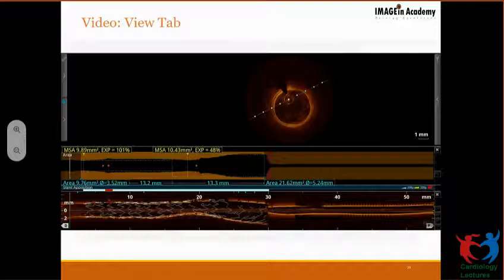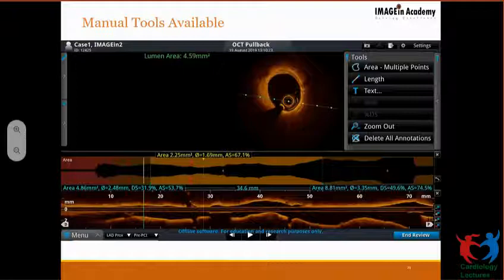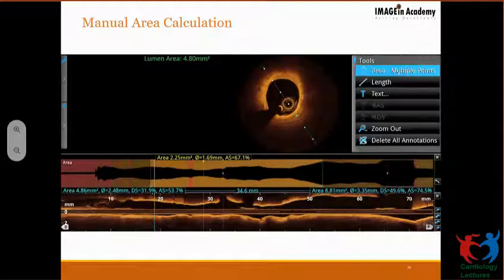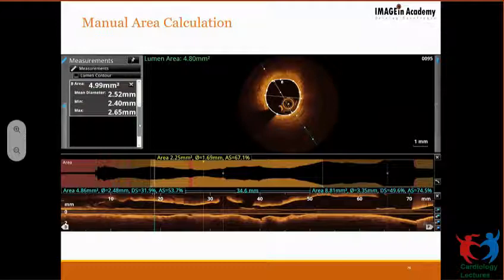Now, having seen this rendered image, you come back to the actual measurements. So we go on to the toolbar, which is on the right of the panel, and this will give you a length. Now, using this toolbar, I'm going to select initially, I'm measuring the area. I'm drawing a circle. Once the circle is complete, I have to press the button accept, and I get the area derived diameter. So I get maximum and minimum diameter along with the area.